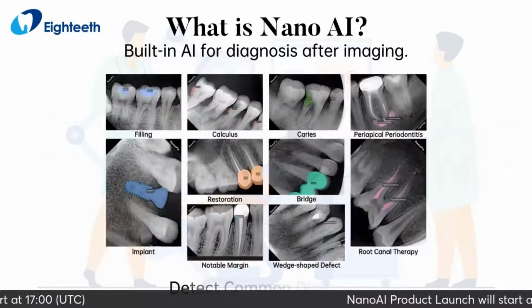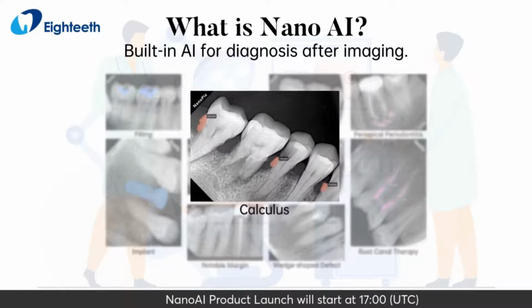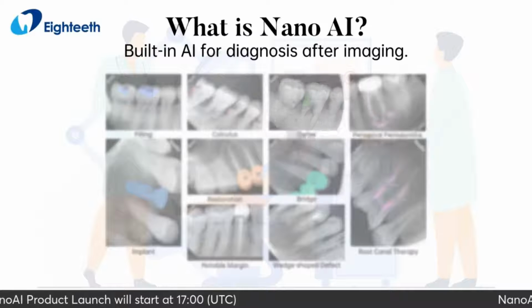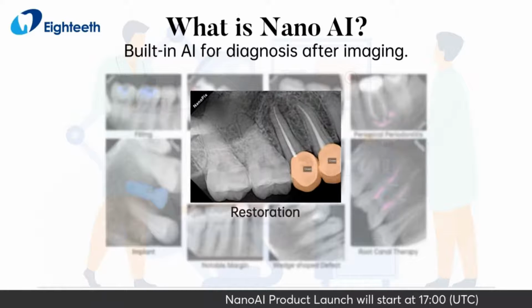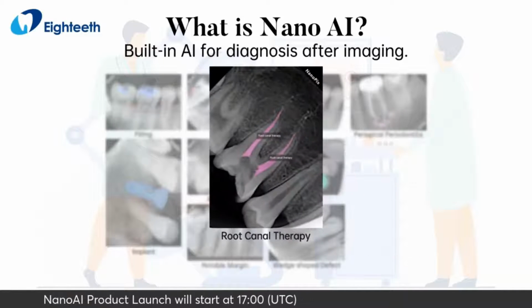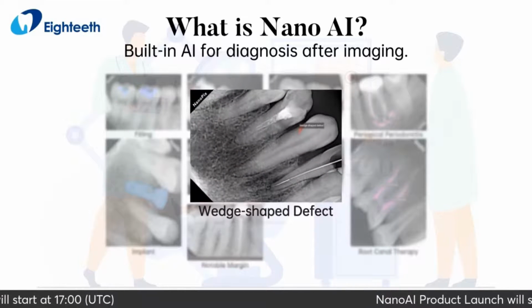and detect common diseases like filling, calculus, caries, periapical periodontitis, implant, restoration, bridge, root canal therapy, notable margin, and wedge-shaped defect.